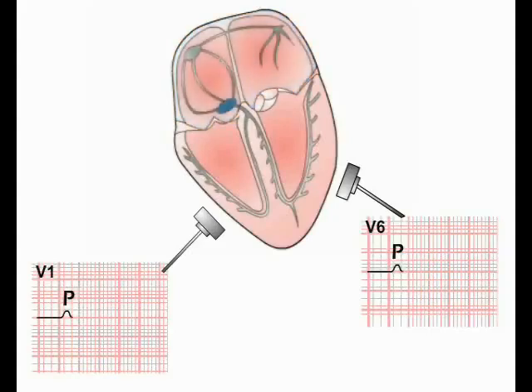After a short delay in which no current is flowing, the AV node allows the depolarization signal to travel into the ventricles. As we've seen, the mid-zone of the interventricular septum is the first piece of ventricular muscle to depolarize, and it does so by signals spreading across the septum from the left towards the right bundle branch. This early depolarization signal is moving towards V1 and therefore produces a positive deflection on the ECG paper in the recording from this lead.